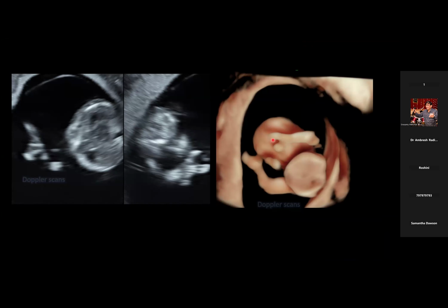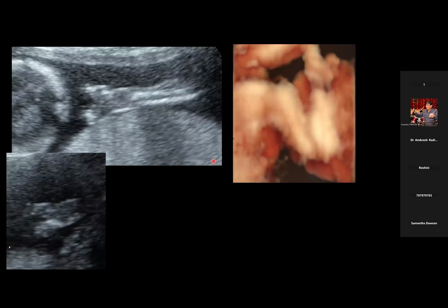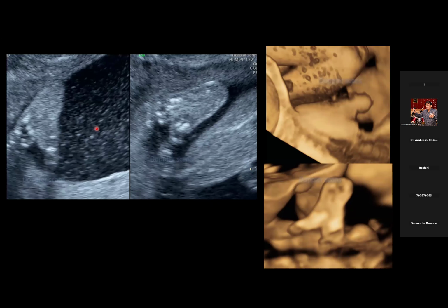So we could make this diagnosis of ectrodactyly in the first trimester because the mother gave us a history of claw hand deformity in the first child. So when we looked for it, we could find ectrodactyly in both the upper limbs. So this was confirmed in the anomaly scan also, both the upper limbs showing ectrodactyly. And there was also in bilateral foot, there was an absent central digit with deep median cleft and fusion of the remaining lateral digits, ultimately producing claw-like deformity. This is called lobster claw deformity.